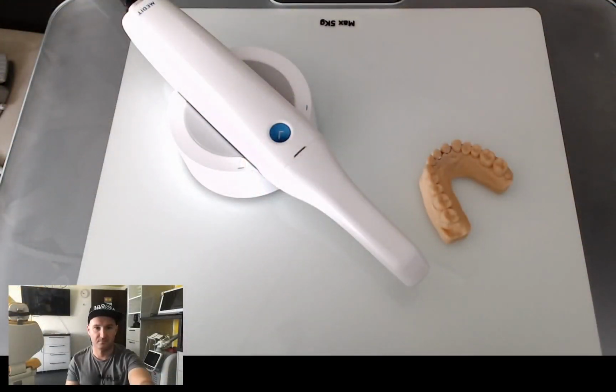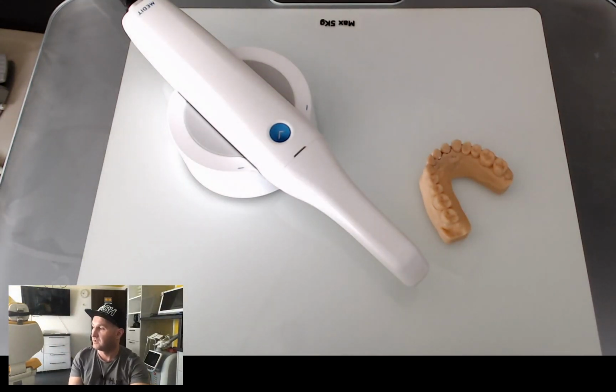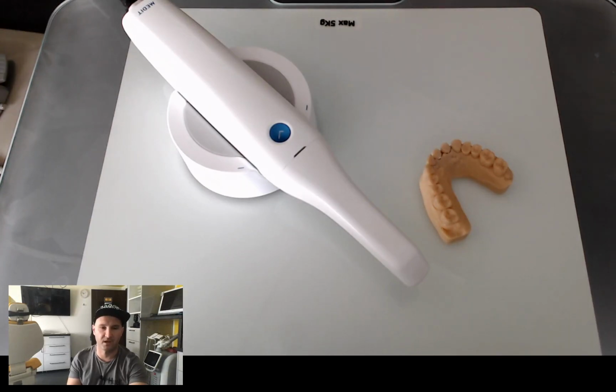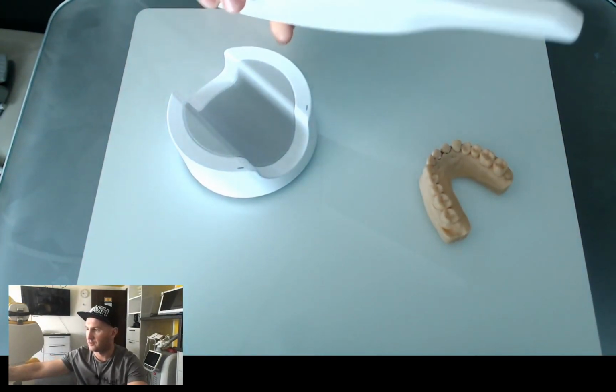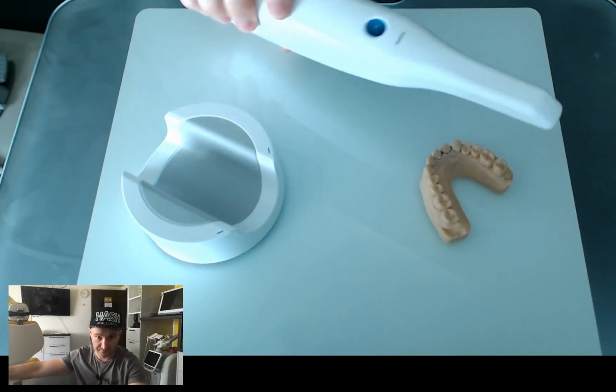And for the first shot, as I thought it would be the best option, we are going to talk about intraoral scanning today. What I mean is I would like to show you how to properly perform an intraoral scan, because it is not as easy as it looks.